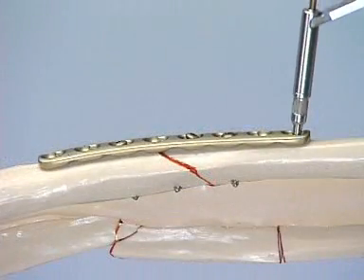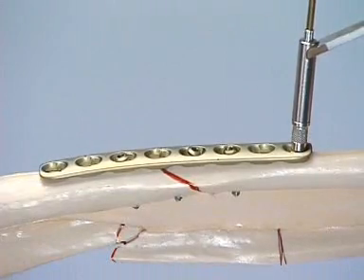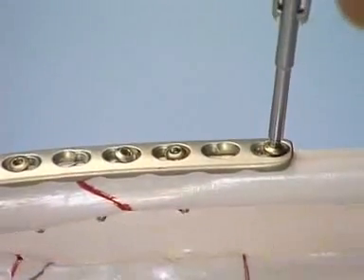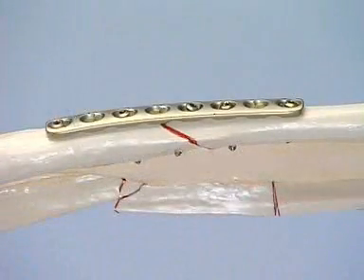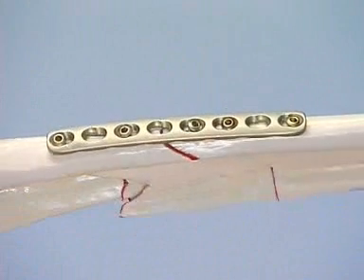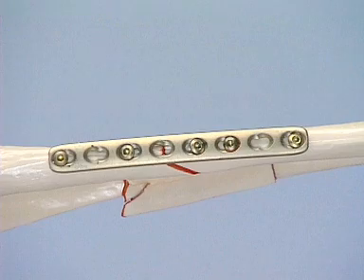To supplement this fixation, another 3.5-millimeter cortex screw is added at either end of the plate. The five screws should provide sufficient stability in normal bone, although in the case of poor bone, all the plate holes apart from the hole over the fracture should be filled.